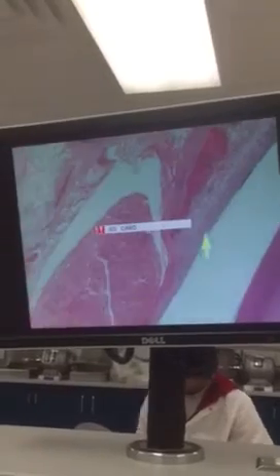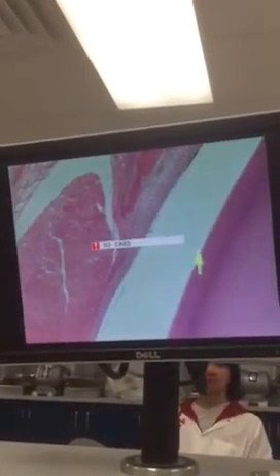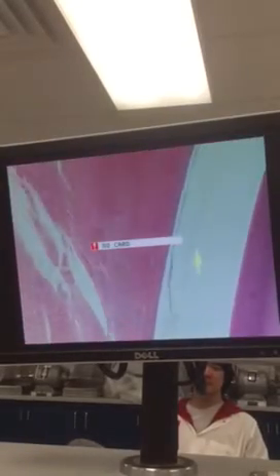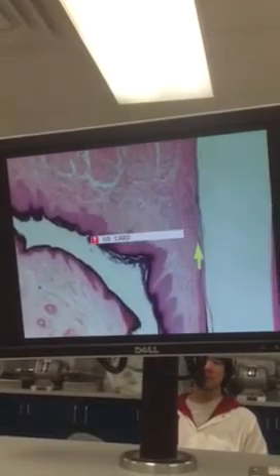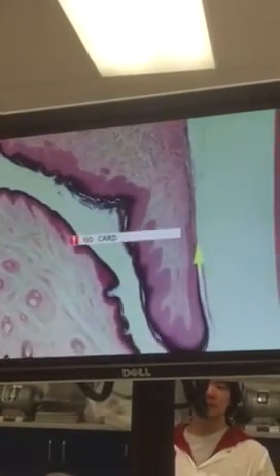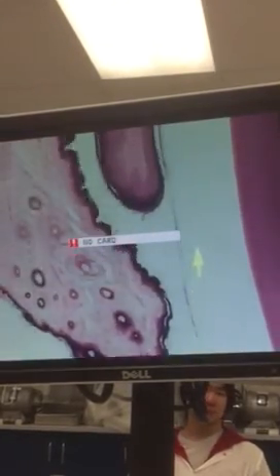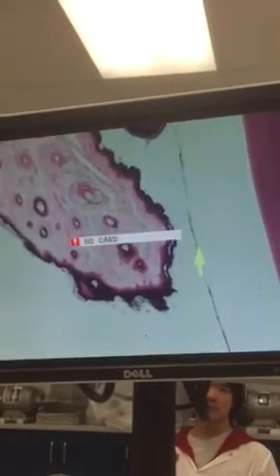Let's back off with the magnification here. In fact, as we keep on going, recall this is the enamel space right here. This is dentin. Get down here, and right in here we have a junctional epithelium. That would be the sulcus, and then we're out in the oral cavity. Now this line that we're seeing right here is some fragment of the old epithelial attachment. And by the time we get out here to the tip, we have a nice sharp tip. So go ahead and take a look at that slide.